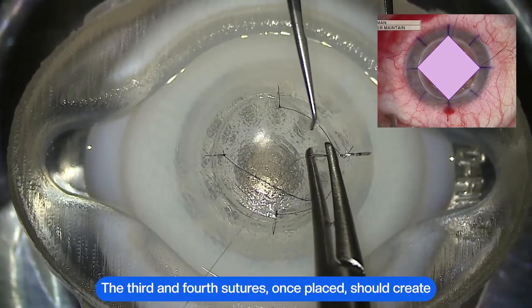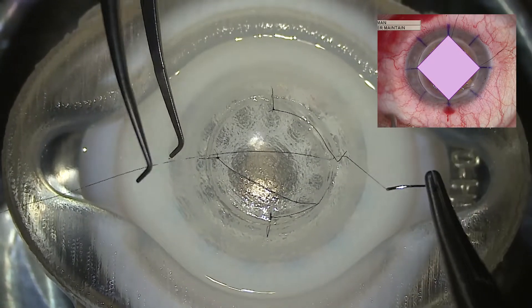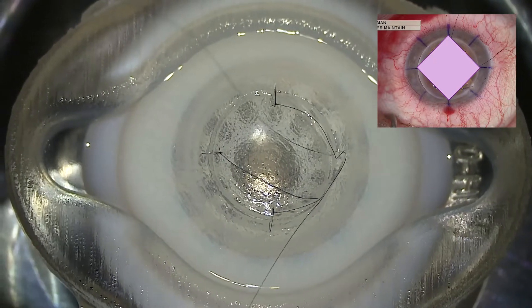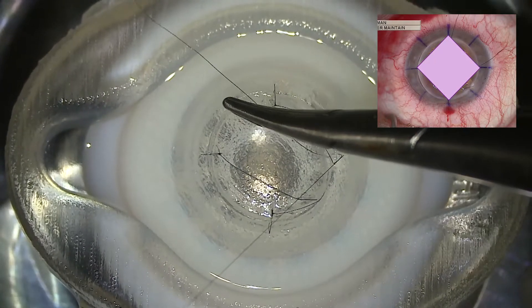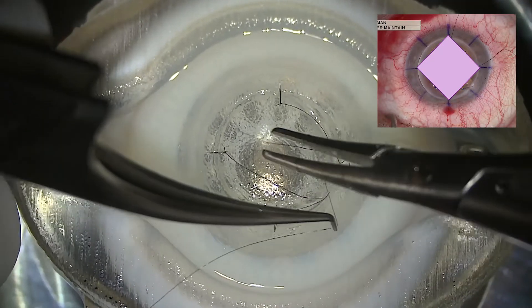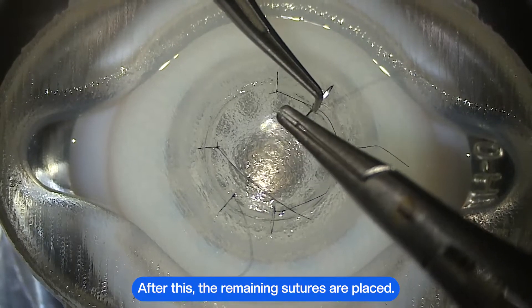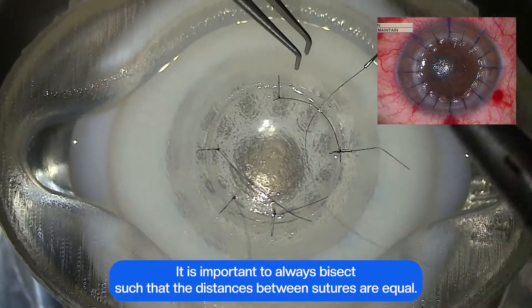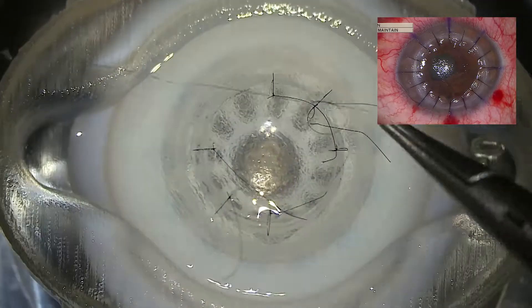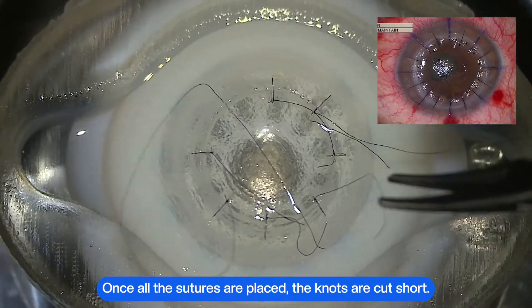The third and fourth sutures, once placed, should create a diamond configuration. After this, the remaining sutures are placed. It is important to always bisect such that the distances between sutures are equal. Once all the sutures are placed, the knots are cut short.